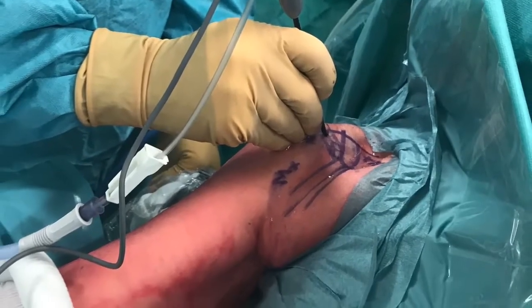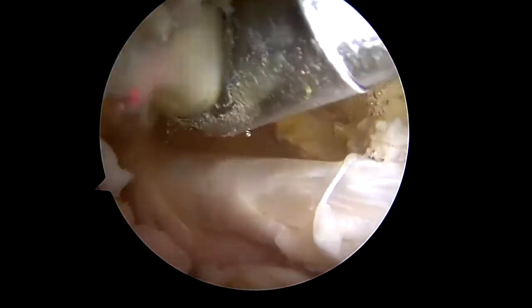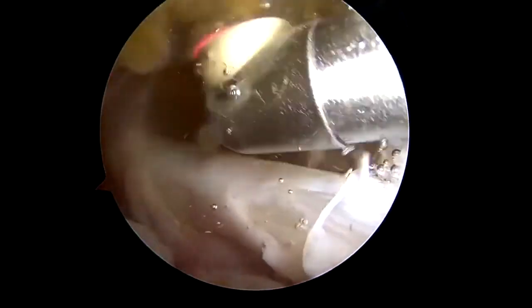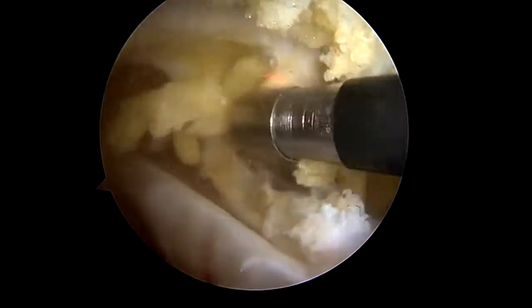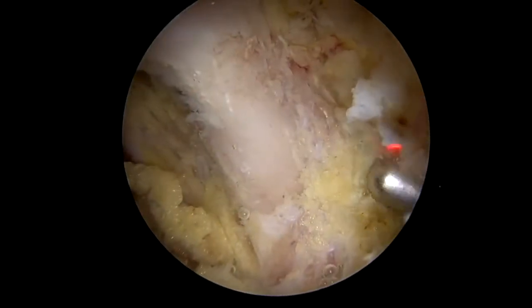The rotator interval is debrided via the north-west portal. The subcoracoid space is cleared using electrocautery. Dissection is only made medially as far as the medial border of the coracoid. The coracoid inferior surface is debrided and the conjoint tendon is identified.